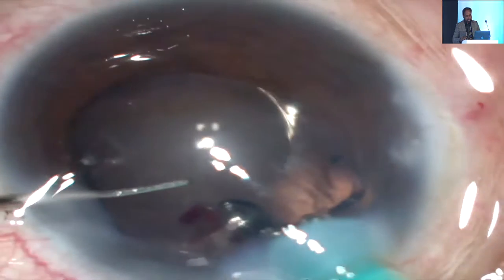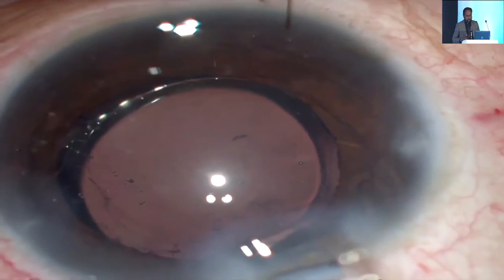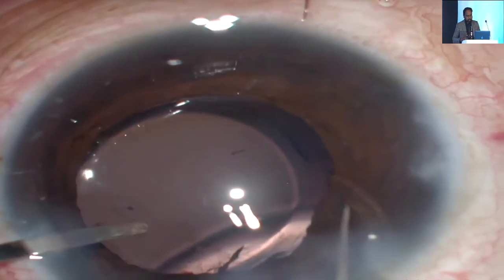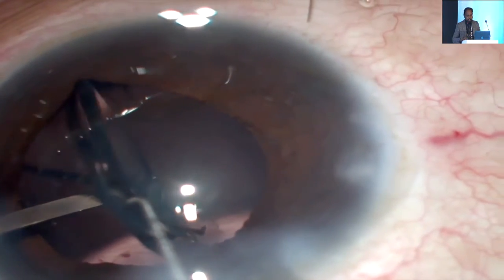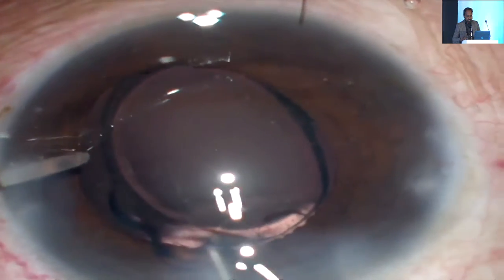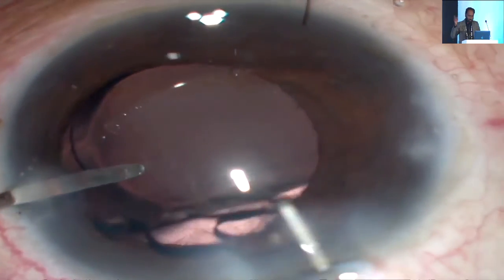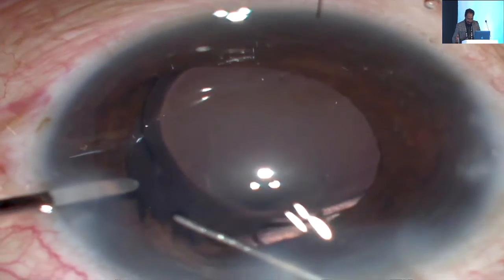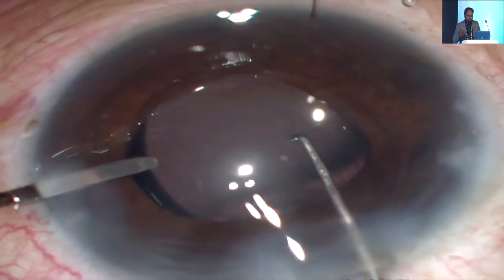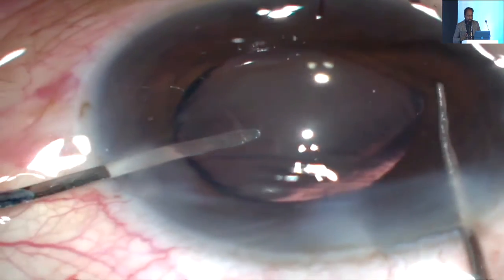But sometimes when the entire lens flips, you can just inject viscoelastics again to protect the endothelium and the bag. But here, because it is a hydrophilic material, it's slightly easier to flip these lenses. And it may not be the same when you're doing it with a hydrophobic, because sometimes you don't want it scratching the endothelium. The cornea surgeons here will not agree, because it's tougher when you have physical damage to the corneal endothelium, which is not going to heal.